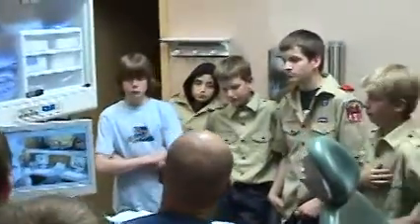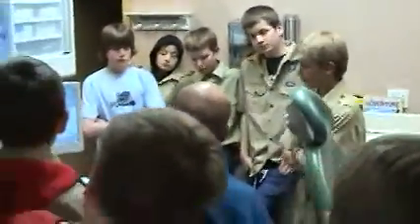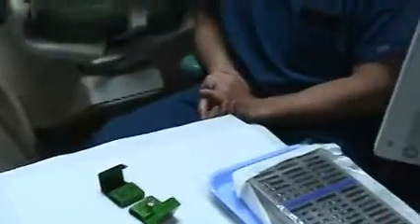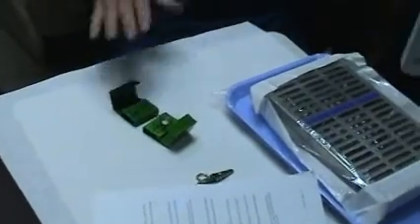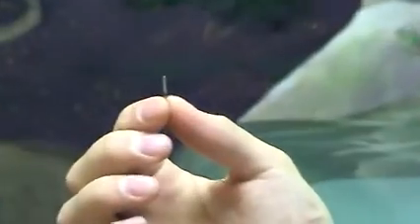What I have here, these are what we actually put in your mouth. These are the business end of what we do when we're fixing cavities or doing crown preparations or any number of those things. Anything restorative wise, we're going to use these drills. I'll show them to you. Don't grab them just because I don't know that they're clean.